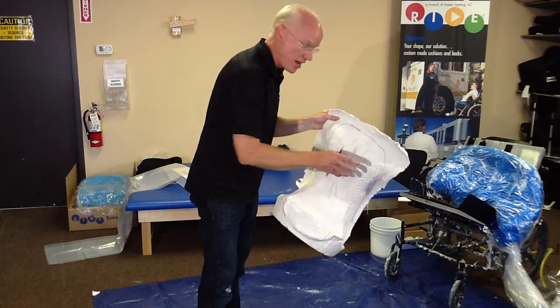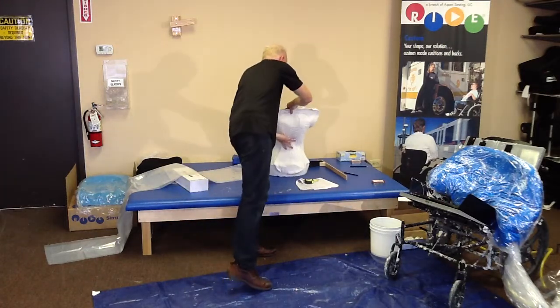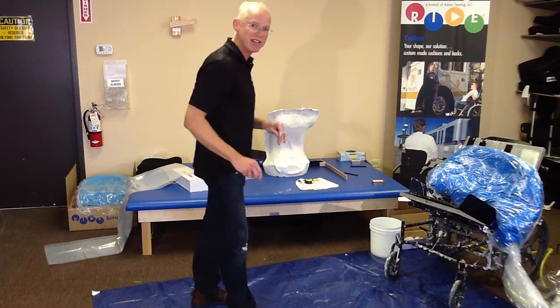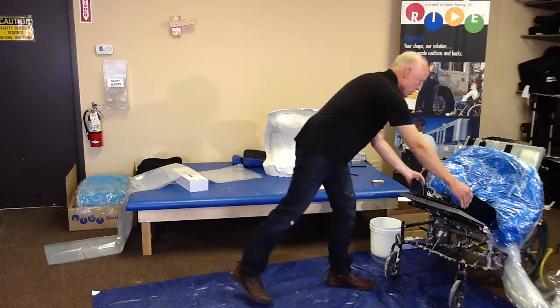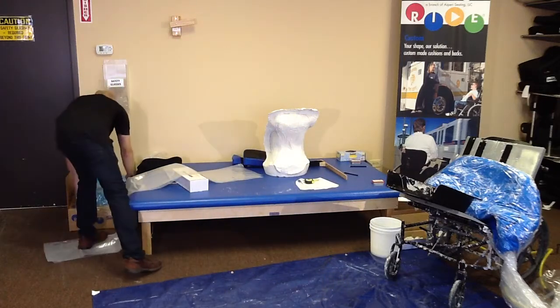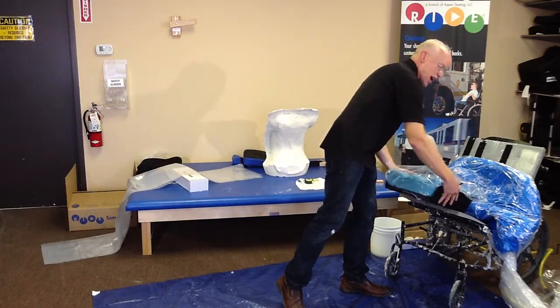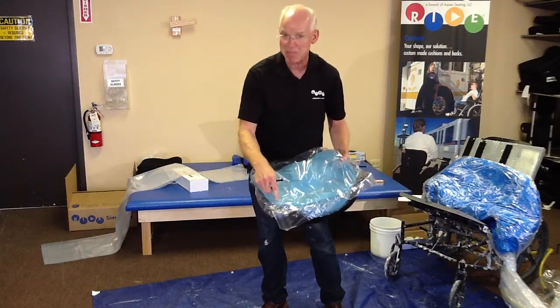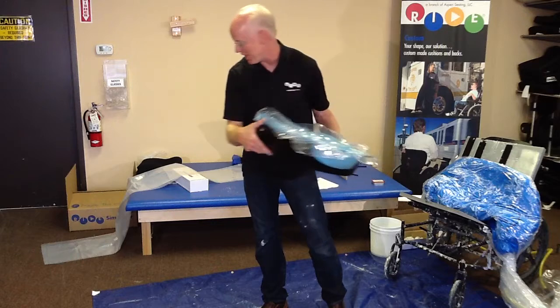With this done now, all the information on the front, order form completed, I can set this aside and we'll let that cast sit for a couple days before I put it in a box to ship into Ride Designs with a copy of the order form. What I am going to do at this time is put Jenn's impression back into the shell. Always make sure you ship the impression foam shape in a pan. If you forget to put the pan, and just put the shape in the box, you'll send us a box of dust. So make sure you return the blue foam to the pan.